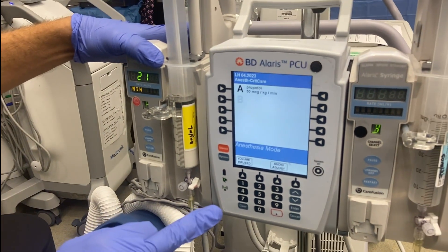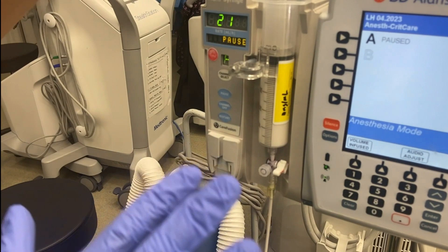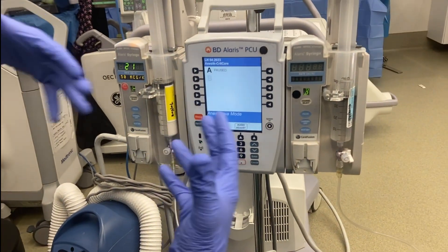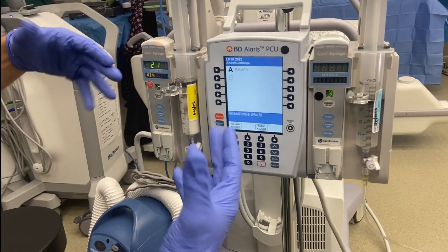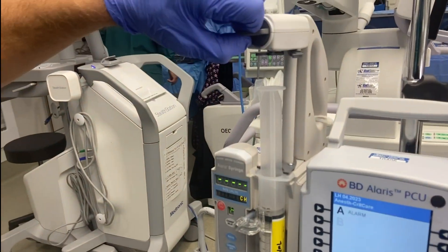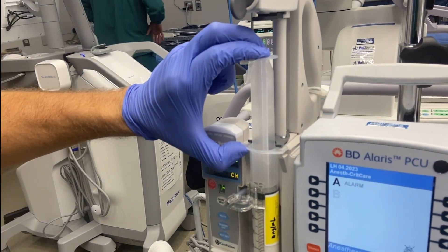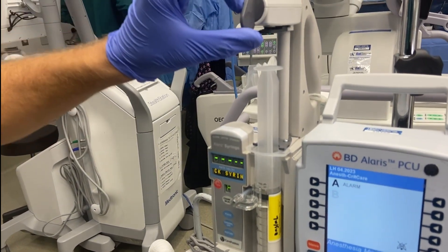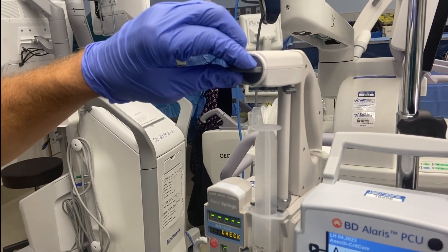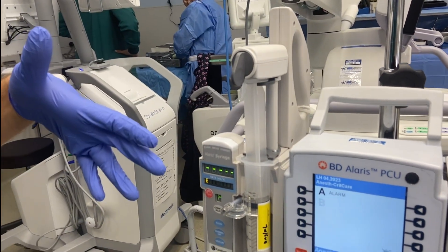If I want to stop the infusion at any time, I would hit pause. Now let's say that the patient gets light and I need to pull this propofol really quickly — I can go up here real quick and silence that. Then I could just push down on the plunger, push this back down, and then I could start my infusion again.